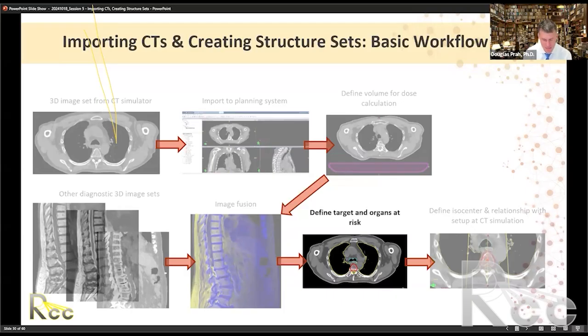What you have is you would beam on for maybe 15, 20 seconds, but then they have to catch their breath, right? And you basically have a machine that's sitting there doing nothing while the patient's catching their breath for the next series of monitor units you're going to deliver. So it's not always very practical to do VMAT, I would say. And in general, we tend to not do VMAT DIBH delivery, at least until we can come up with ways to improve the delivery time. It's a really big struggle.